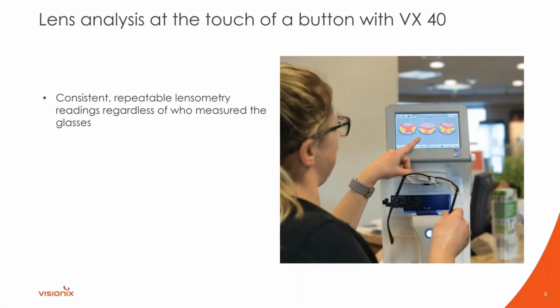Now, after the glasses are analyzed, you have two options. First, you're able to consistently, repeatedly get the analysis of your glasses with any tech that has that ability.